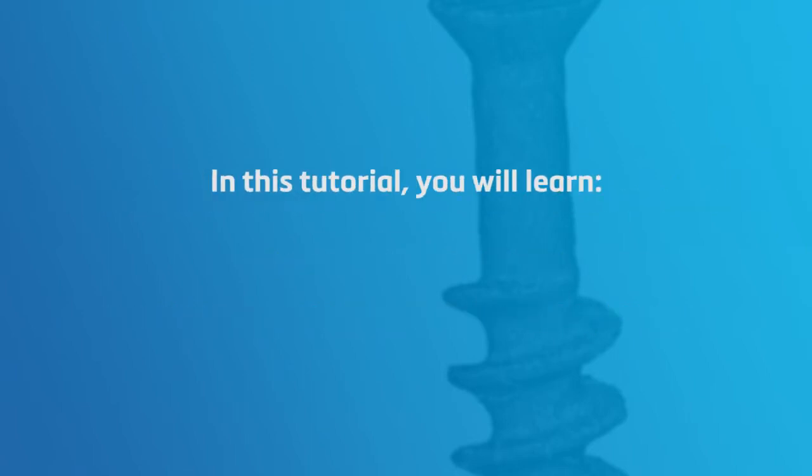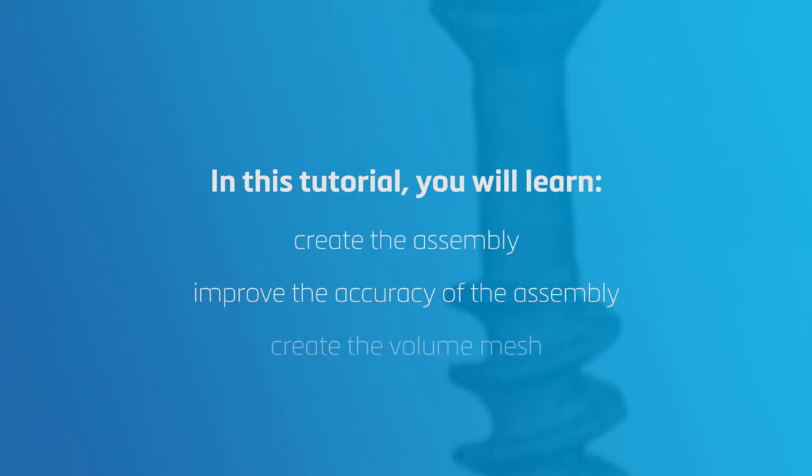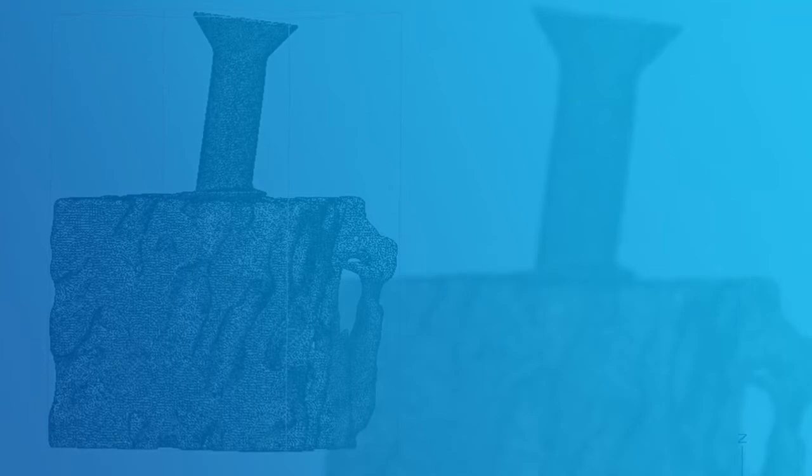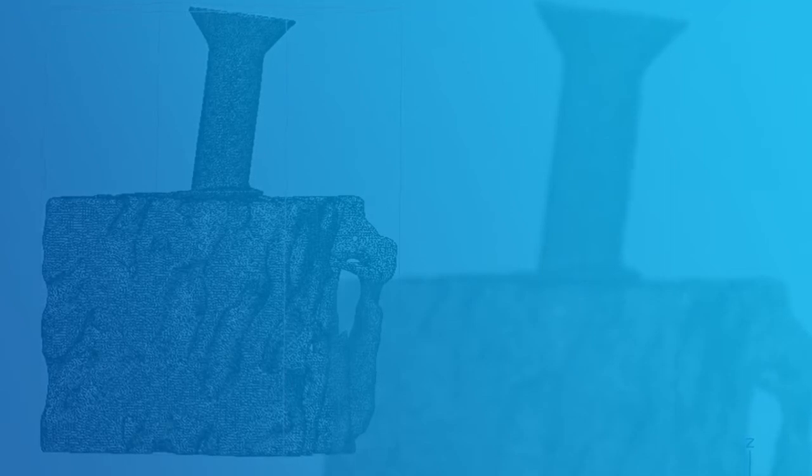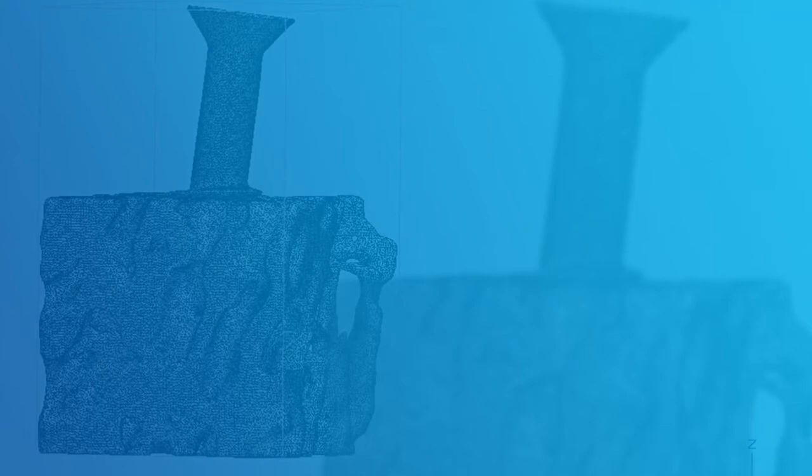We will first create the assembly, then improve the accuracy of the assembly by projecting the surfaces back on the original parts, and finally create the volume mesh. To do this, we will use a trabecular bone featuring a screw embedded in the bone. Please use the trabecularscrew.mxp file from the demo files for this exercise.